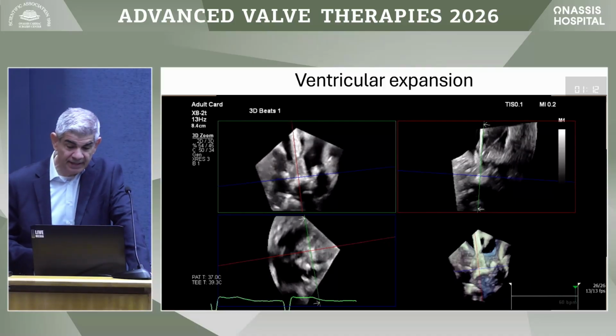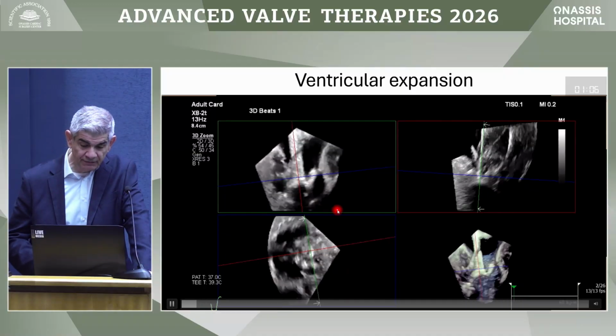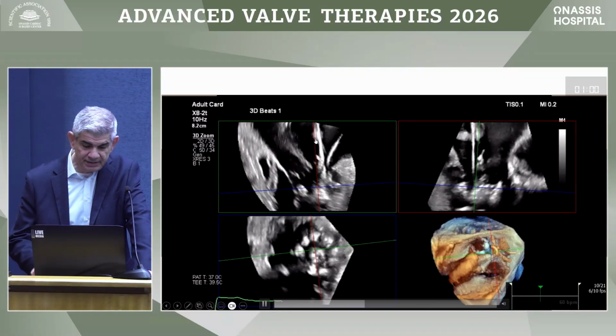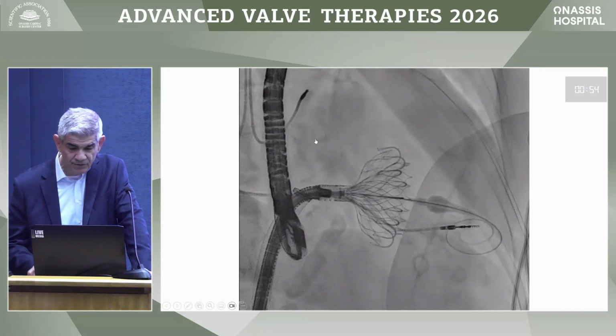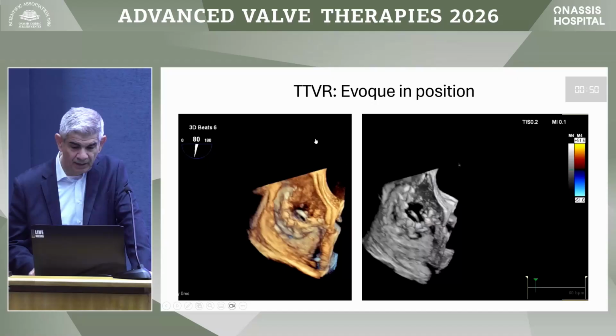Again, here, less potential for movements, but still, we would like to do our spinning again, starting from this anchor down here, making sure that there's leaflet engagement, same all across, all around, before we decide to further do the atrial expansion and final release of the valve here.